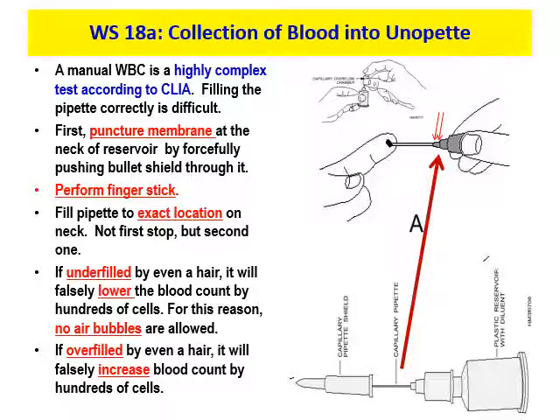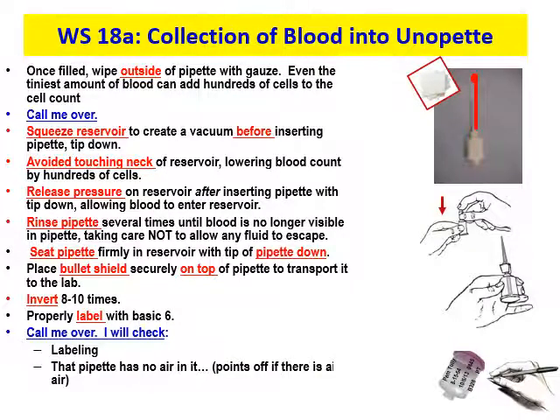We take our time to make sure collection is done spot on because we want to give out a valid result. The procedure is lined out in Chapter 9 as well — the pipette must be rinsed with the fluid from the reservoir to make sure all the blood comes out of the capillary pipette and gets down into the reservoir. Once the pipette is filled, wipe the outside with chem wipes or gauze, because even the tiniest amount of blood on the outside can add hundreds of cells to the cell count.